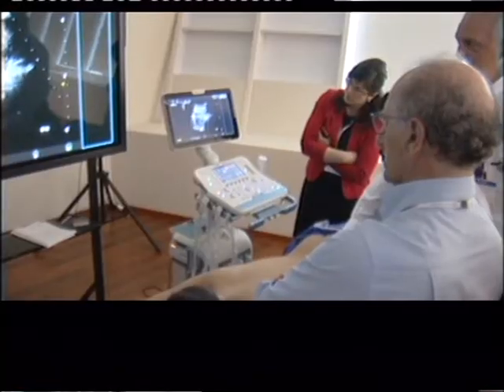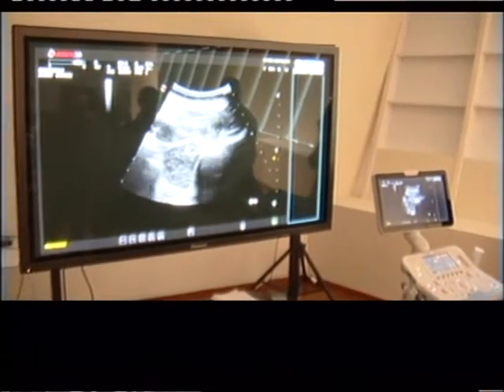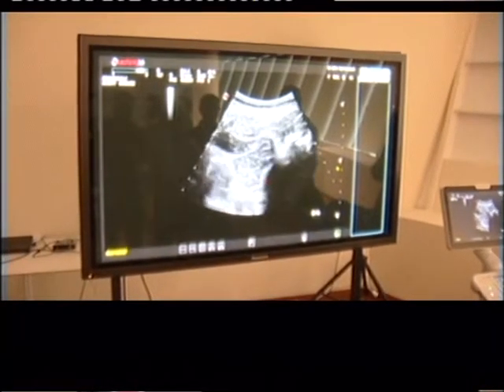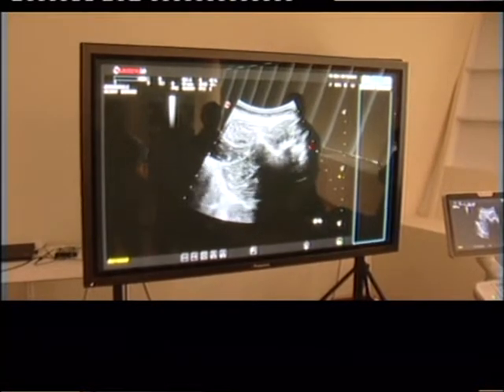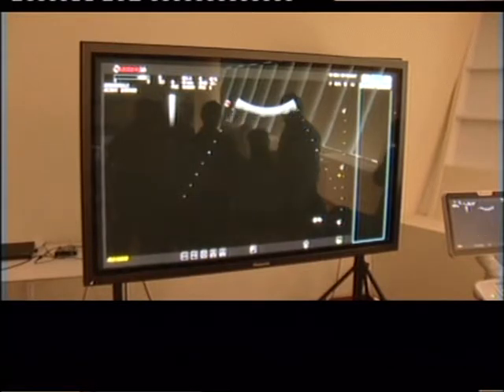The aorta's down here, lumbar plexus. See? Nerve root coming out. Now we go to the W. There's the W. And then there's the medial branch right in the middle there. Okay, now you do it.